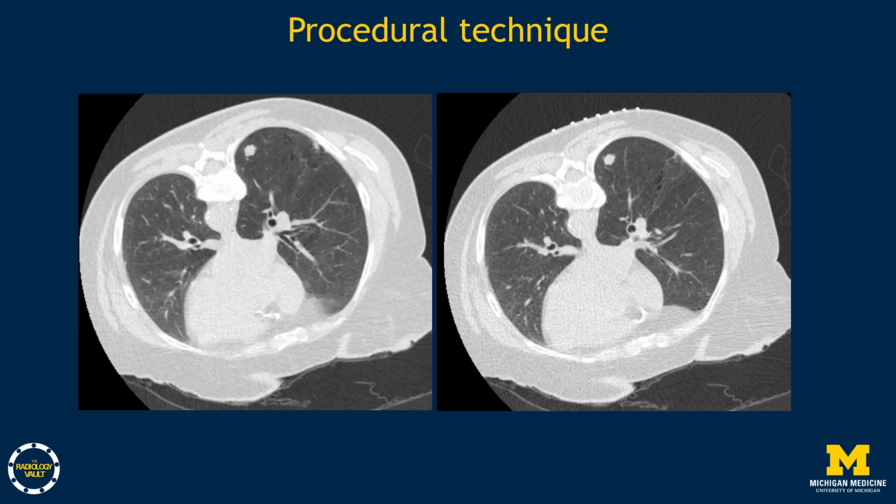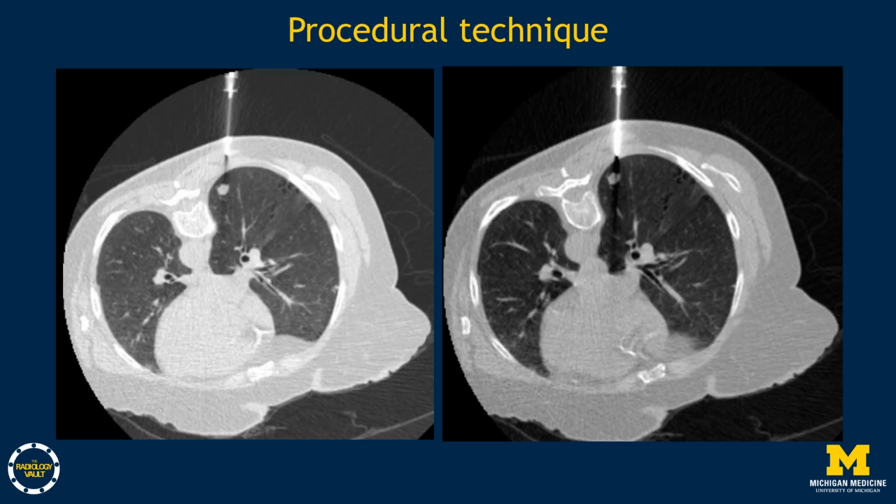Referring back to the patient with the new lung nodule, the patient presented for biopsy and was placed prone with a slight wedge under the right side for comfort. Initial images localized the nodule and confirmed a safe trajectory. A radiopaque grid was applied to further define the skin entry site. After proper skin cleansing, draping, and administration of local lidocaine, the introducer needle was advanced under CT fluoroscopic guidance. Once the pleura was reached, additional lidocaine was administered and the final trajectory was confirmed.